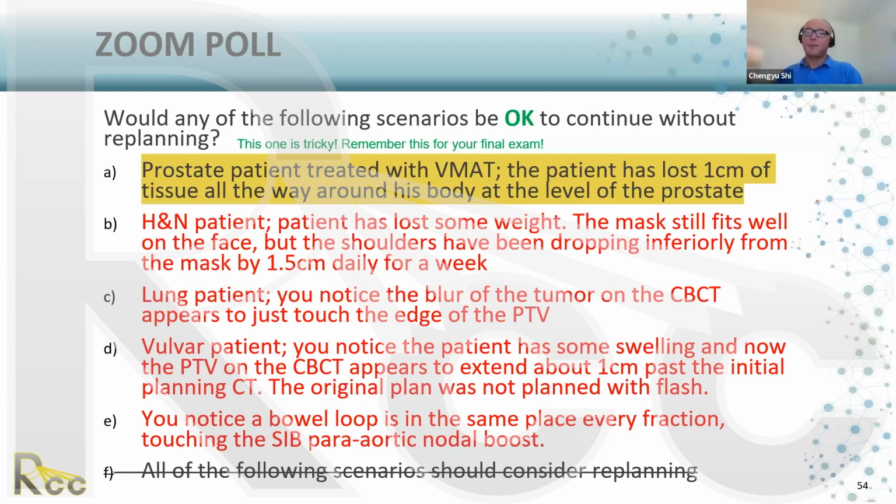So the prostate, usually VMAT has a forgiveness for differences. And I did publish a tomotherapy plan comparison, and later on people published VMAT, so they're okay. But the others may not be. You know the tricky part: usually 'all of them' or 'something' means it's not good. Only 'all' or a keyword like that is not a good answer. So when we give the ABR exam, I'm an ABR general exam writer, we will never use that word. So the others, there are definitely those differences.